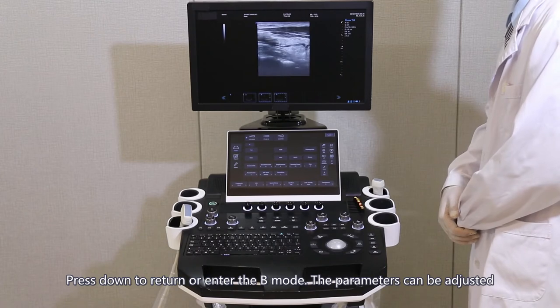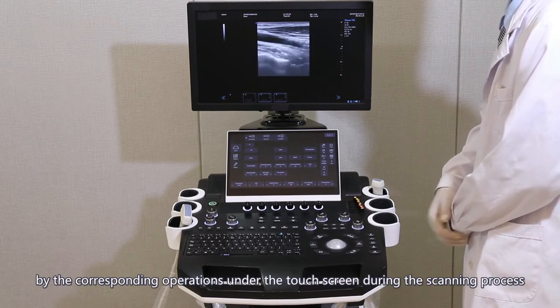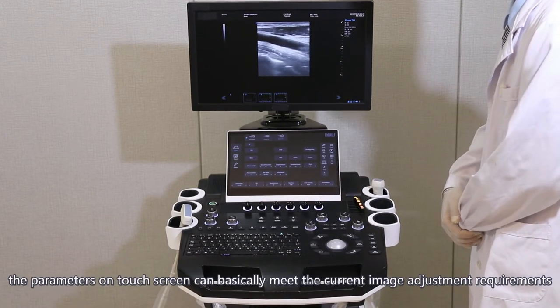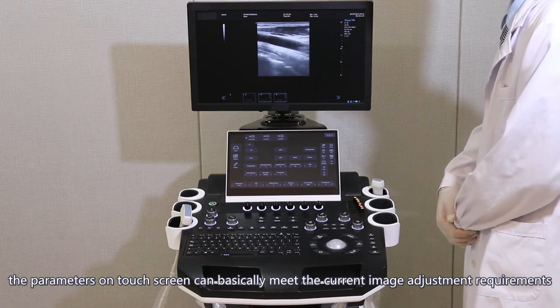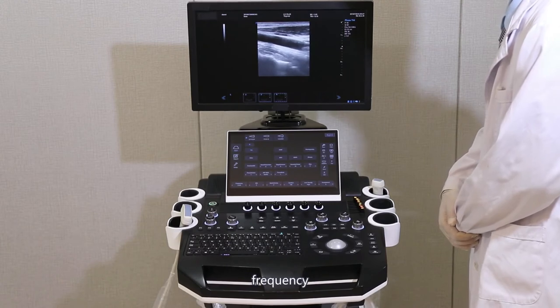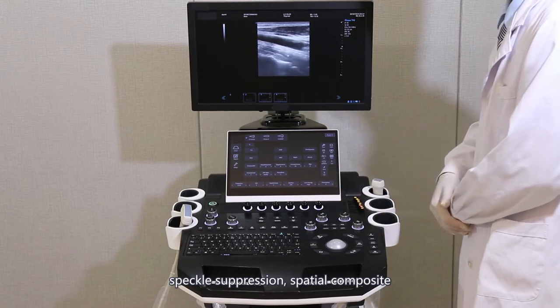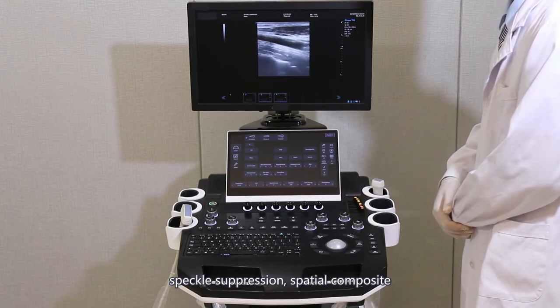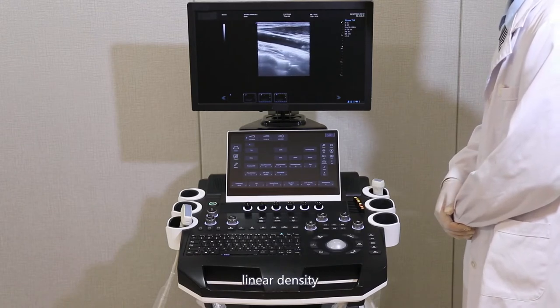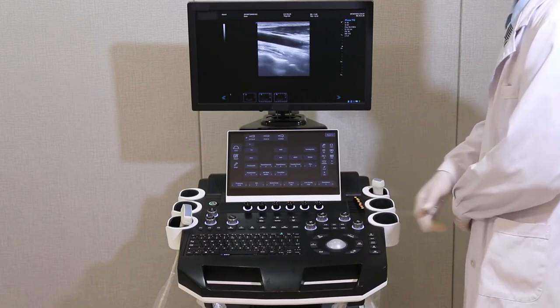Press down to return or enter B-mode. The parameters can be adjusted by the corresponding operations on the touch screen during the scanning process. Parameters on the touch screen can basically meet current image adjustment requirements, for example: frequency, speckle suppression, spatial composite, dynamic range, linear density, frame correlation, and so on.